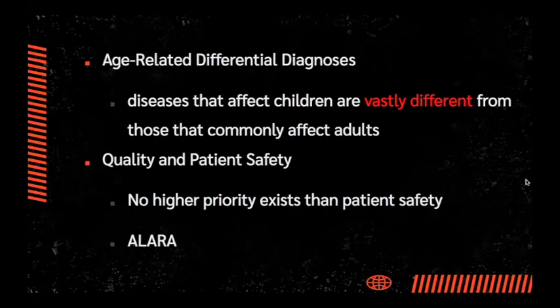All right. When we try to conclude the diagnosis based on the radiograph, we need to bear in mind it should be age-related. What is common in infants will be less common in older children. And as we know, the diseases that affect children are vastly different from the adult.